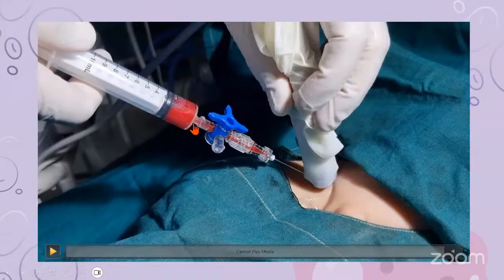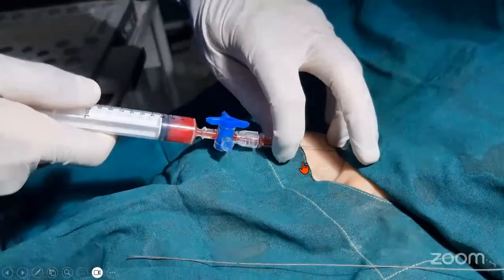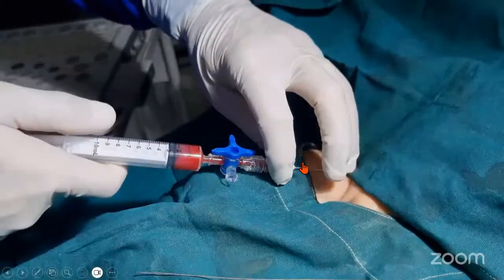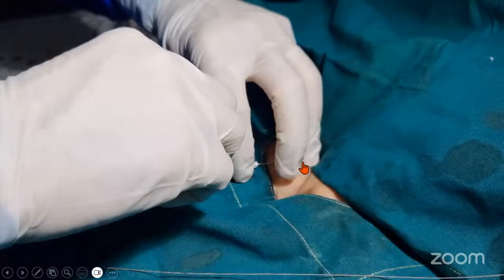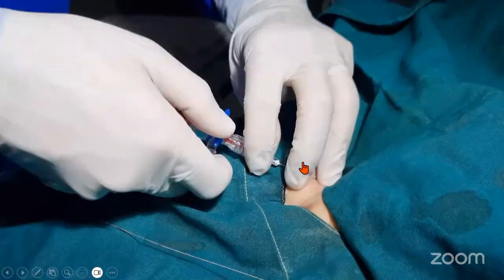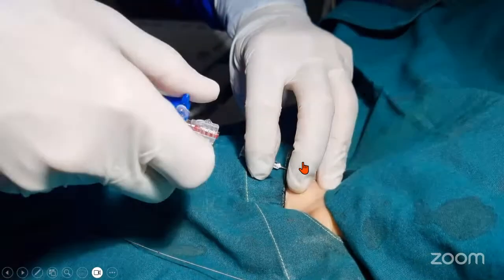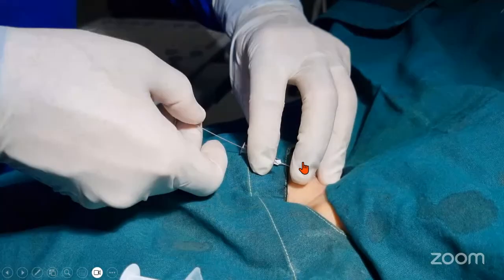when you take a plunger and withdraw, you will see the blood coming out, and then with the Seldinger's technique, you withdraw, take off the probe, and then you take out this syringe. Okay, put in the guide wire.